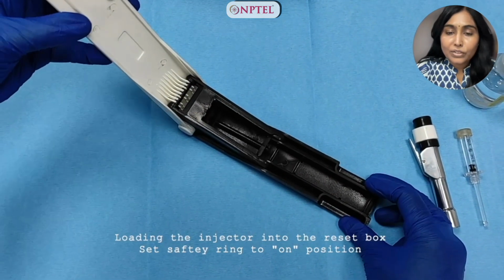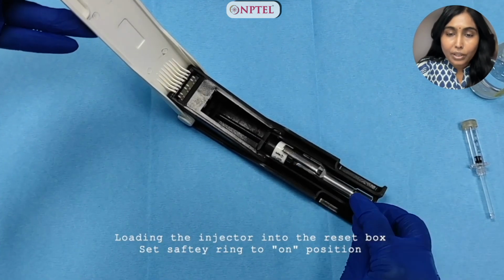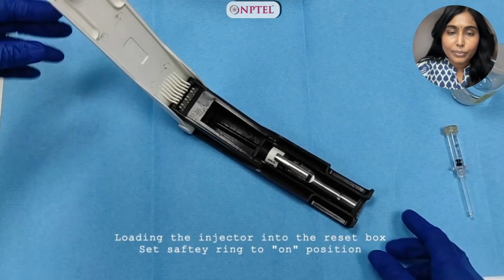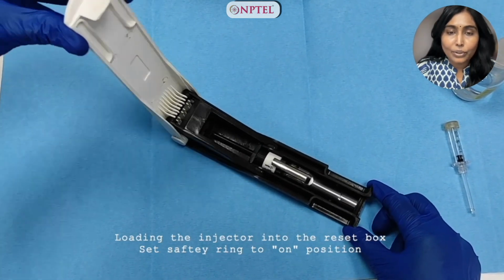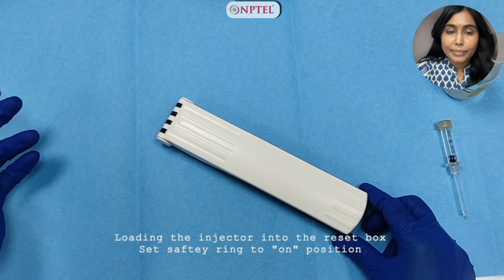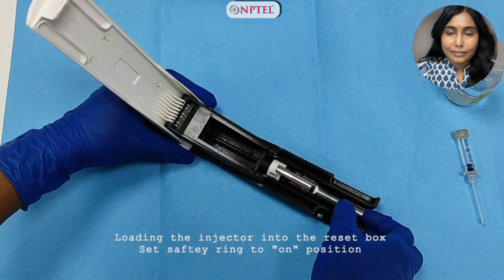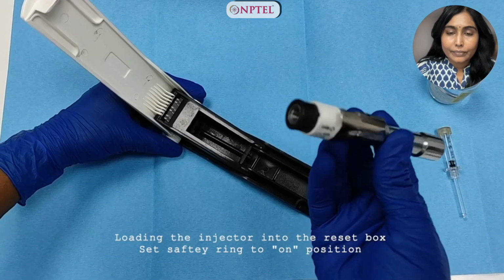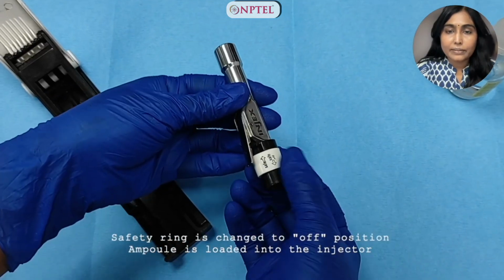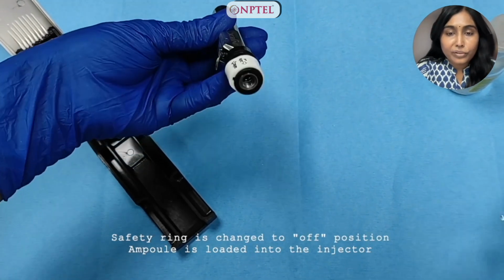Now we're going to load the injector into the reset box. Remember to set the safety ring to on position. It's in the on position now. Position it inside the reset box. I'm beginning to activate by closing the lid. Now the injector is all set, activated. The safety ring is now changed to off position.